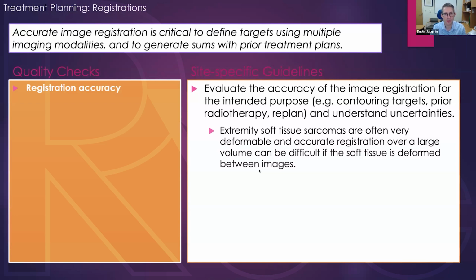Our main concern with not treating through the leg is it can be difficult to reposition the leg. And so that position might vary day to day. And as a result, if you're planning, hey, this target volume is 3 centimeters deep, and this is how much radiation I need to give to go to 3 centimeters and give the dose I want.